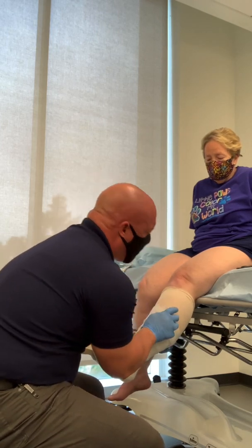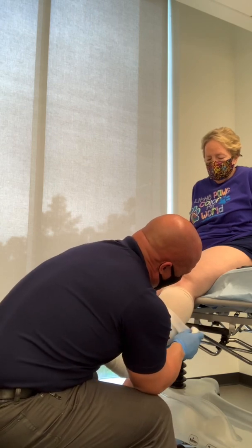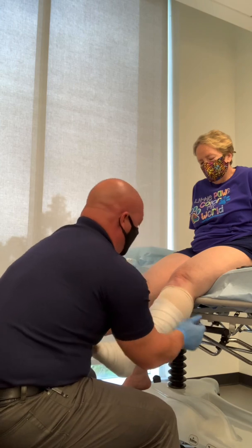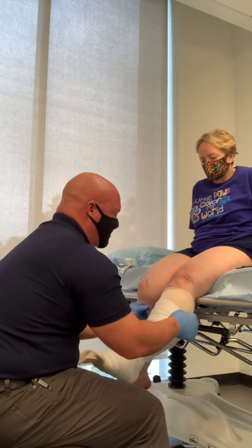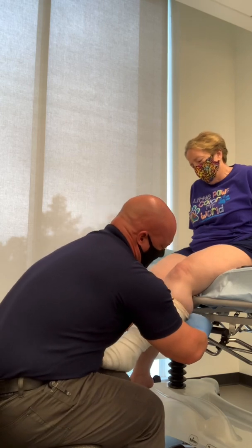You want to come up and clear about two-thirds of the gastrocnemius with this. So this is going to be a fairly short cast today. Nice and even — we'll take our ends and fold them down. This is really tight.